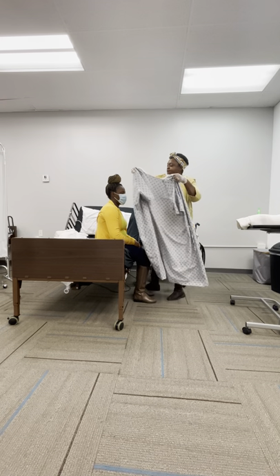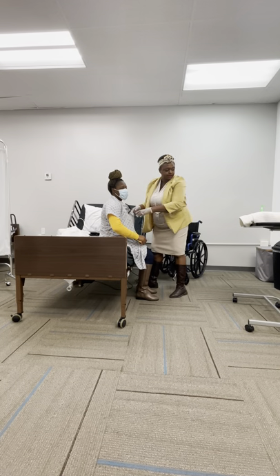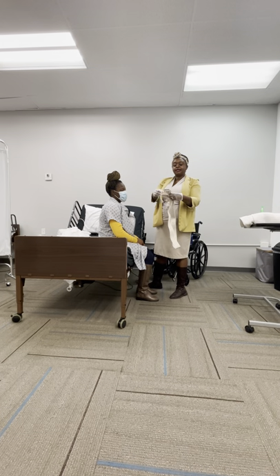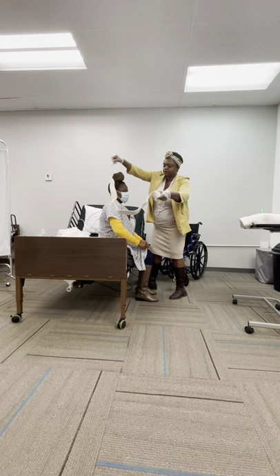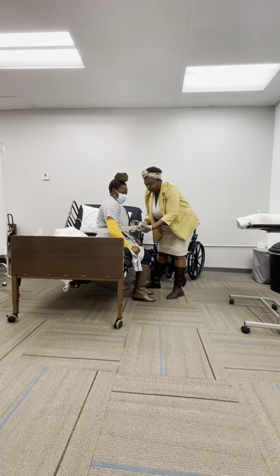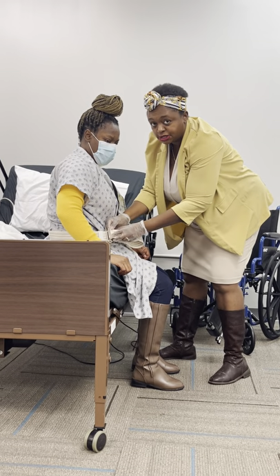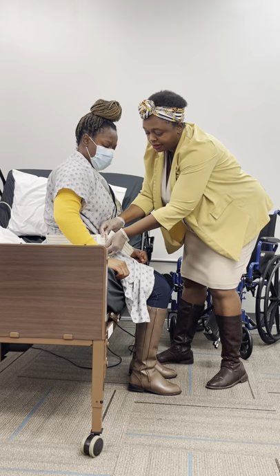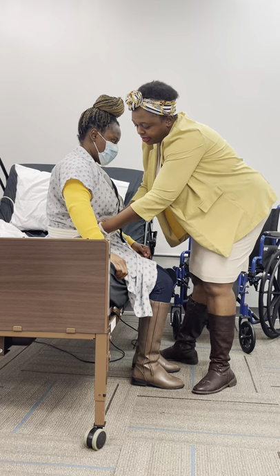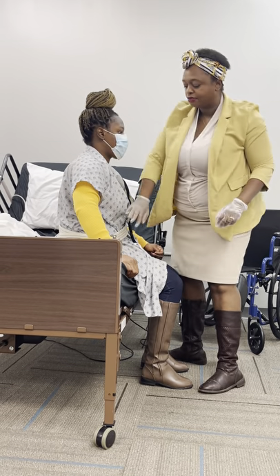I'm going to put a robe on. Now the transfer belt — there'll be another video with more detail, but this is the transfer belt. The belt buckle has to end up off to the side. Make sure it's not kinked in the back. I'm going to wrap the belt. Always be mindful of where you are standing in relation to the wheelchair — in real life I've almost tripped over a wheelchair and patients have almost tripped over it. So take your time and don't rush. The transfer belt is not a tourniquet — it's just a little snug so that you can still get your hands through. The buckle is off to the side.